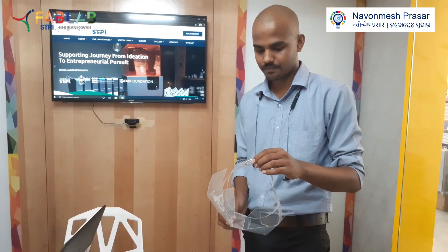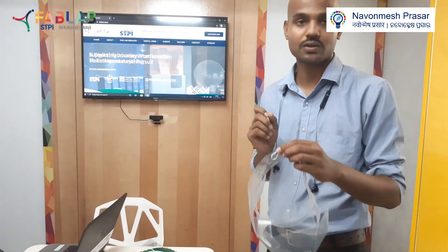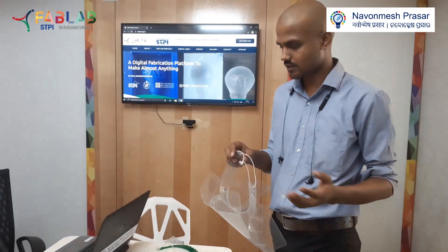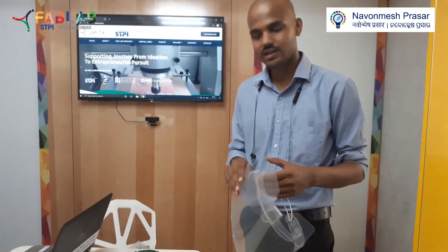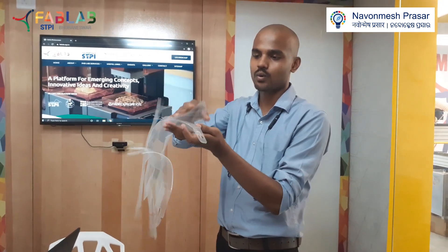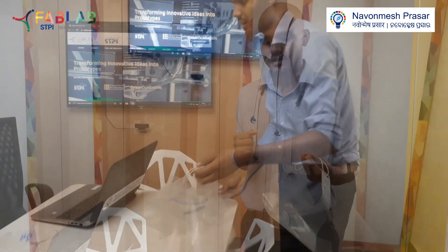Let's compare this design with the existing designs in the market. The first benefit of using this design is the cost — for this design we are only using one sheet, so it significantly reduces the cost. Second is the transportation: since we are providing only these kinds of sheets, they can be stacked one over the other and can be transported easily, so there is no chance of breakage and all that.